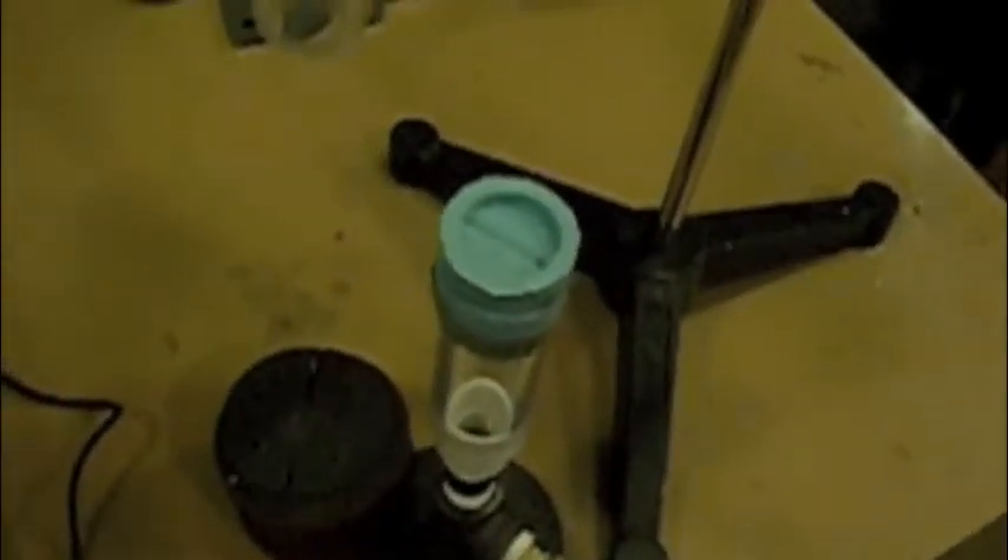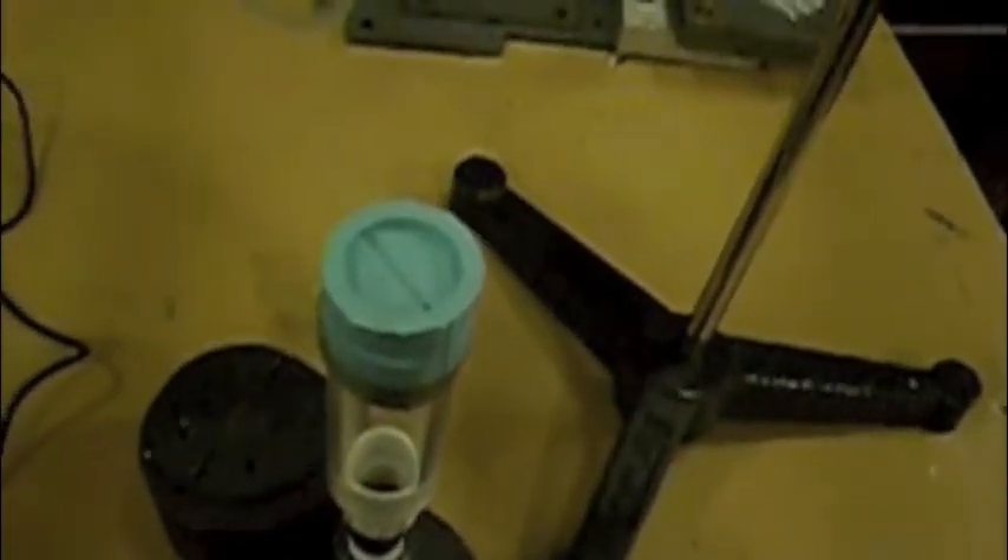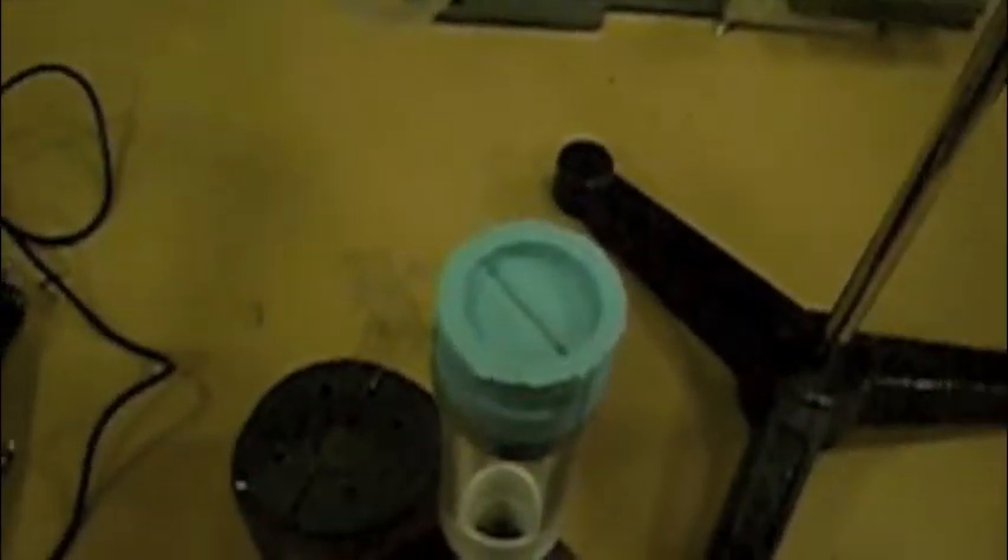Today we have here our model vocal folds, made out of silicone rubber — vocal cords. I have it hooked up to this contraption that will basically supply air to it. Right now it's taped onto this tube, and you'll see as I turn on this air valve, it'll begin to vibrate.